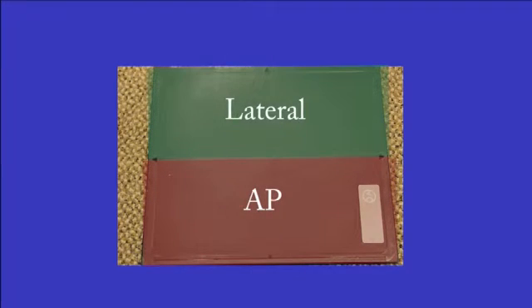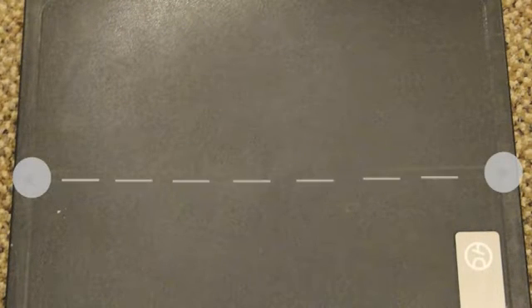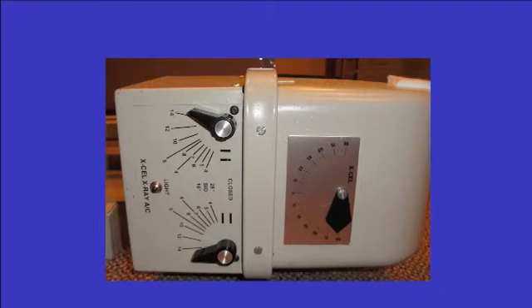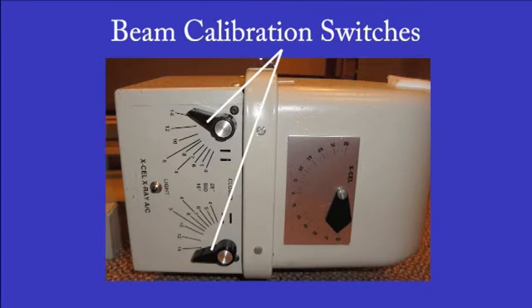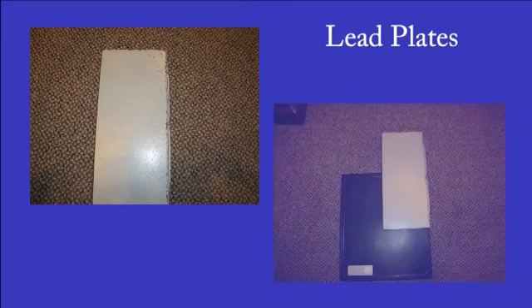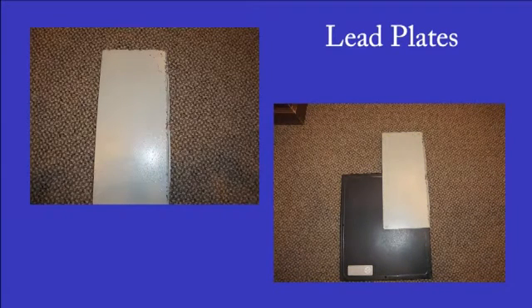If you look at the film, you will see an arrow in the middle at each end. This indicates the middle point of the film. The X-ray machine head has the ability to adjust the ray dimensions, so you can pinpoint exactly what you want to take a picture of. To be safe, we also have lead plates that should be utilized to section off the cassette and ensure you save the other side so that it can have a picture on it as well.